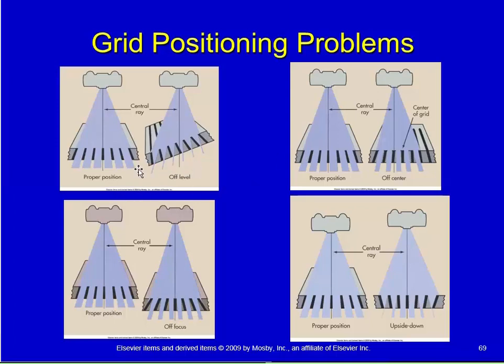It's bad. So let's say you're taking an X-ray on a patient on one of those soft air beds, and it's not fully inflated, and you slide a gridded cassette or an image receptor with a tape-on grid under the patient.